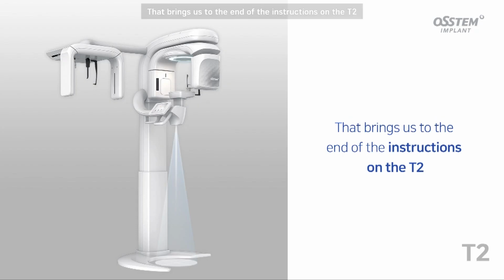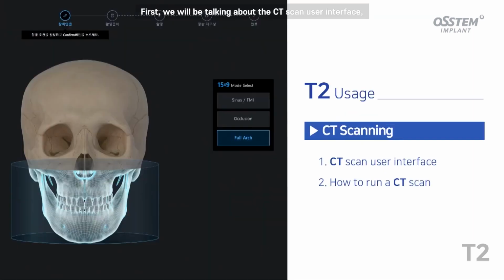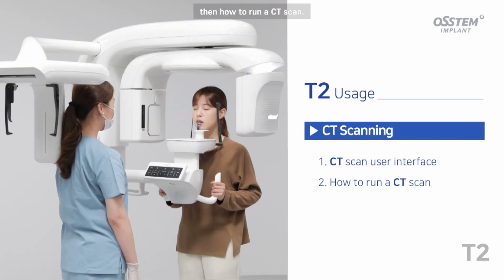That brings us to the end of the instructions on the T2. Let me walk you through how to run a CT scan using the T2. First, we will be talking about the CT scan user interface. Then how to run a CT scan.